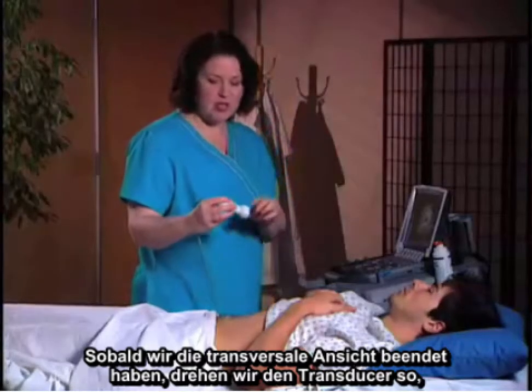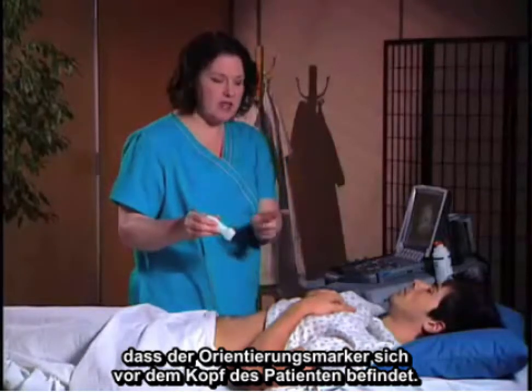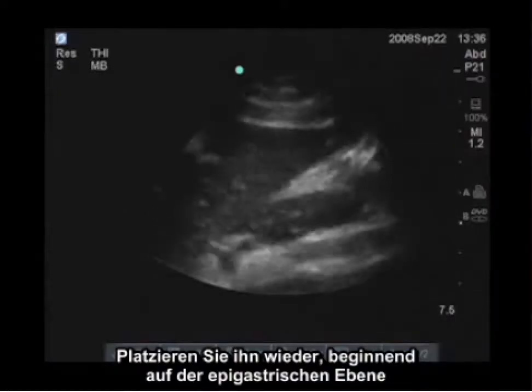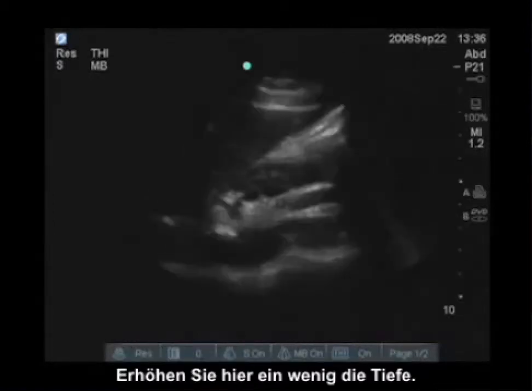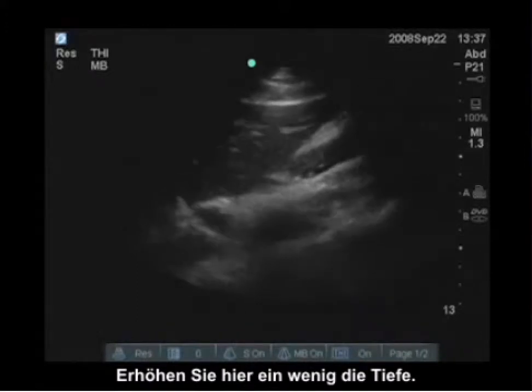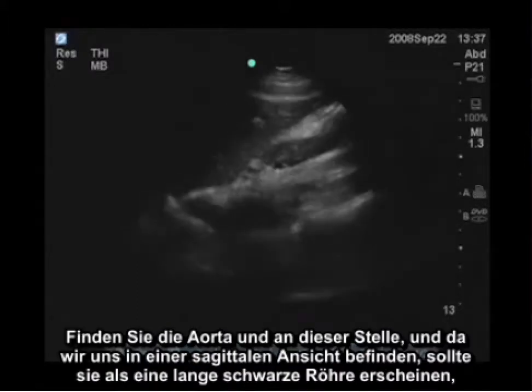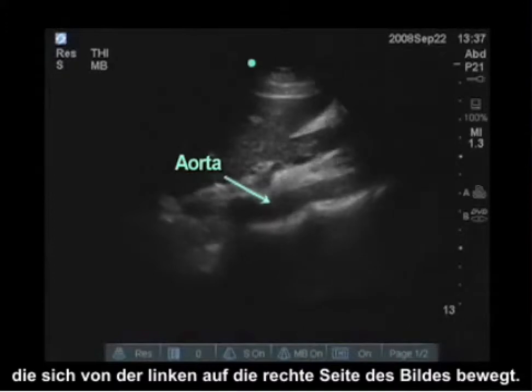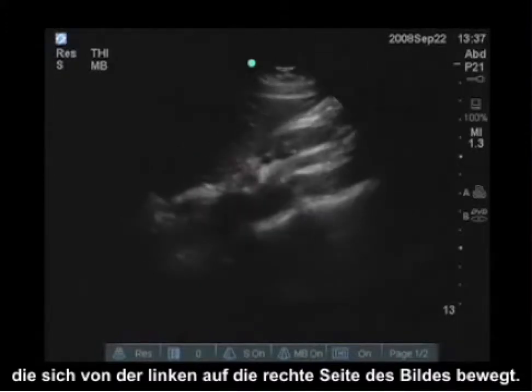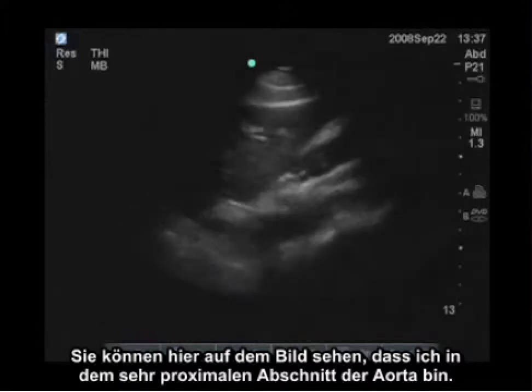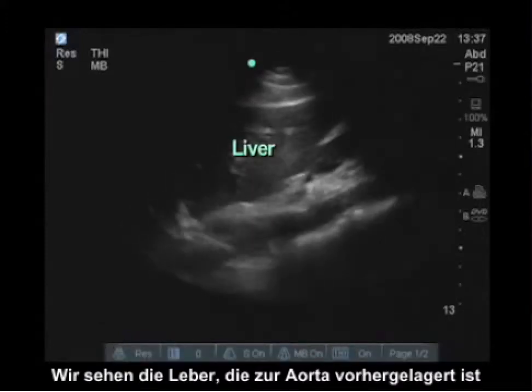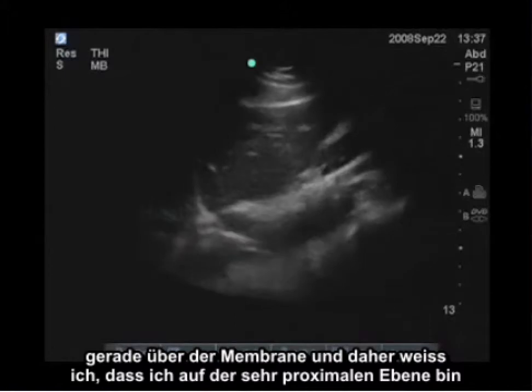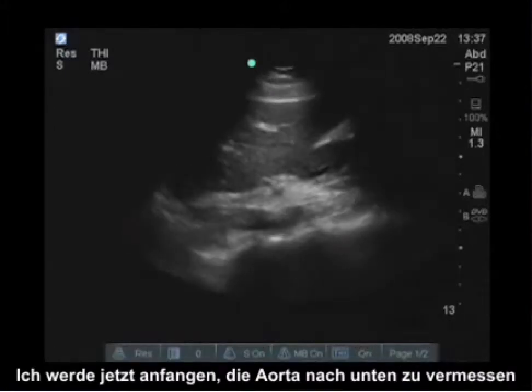Once we finish the transverse sweep, we're going to turn the transducer so the orientation marker is facing the patient's head, and place it again starting at the epigastric level. I'm going to increase the depth here a little bit to find the aorta. Because I'm now in a sagittal view, it should appear as a long black tube moving from the left to the right of the image. We can see I'm in the very proximal portion of the aorta, with the liver anterior to it. Moving up a little bit, I can see the heart beating just above the diaphragm, so I know I'm at the very proximal level and I'm going to start to survey down the aorta.